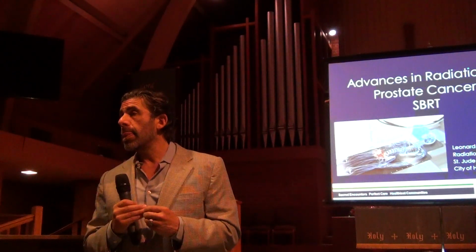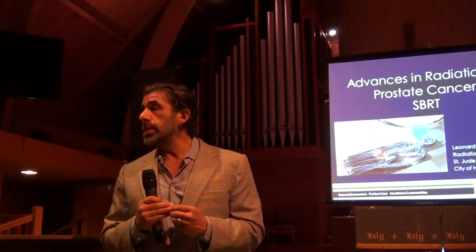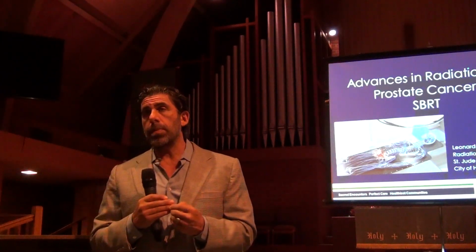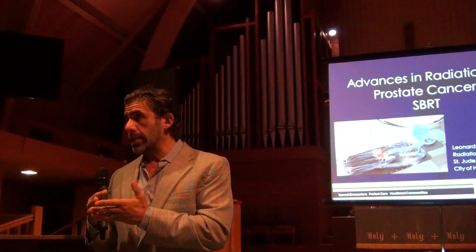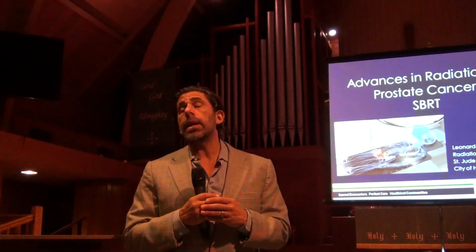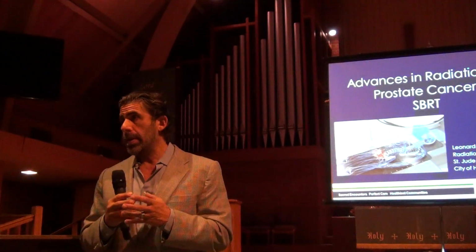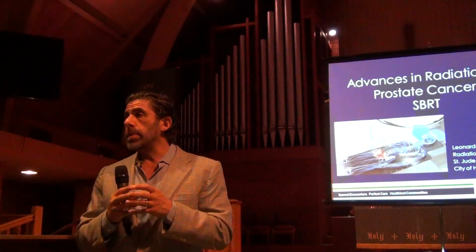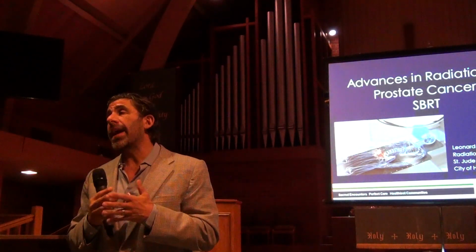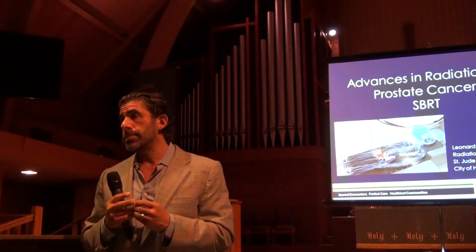Do you do it every other day, or could you do it consecutively? I do it consecutively. There isn't a consensus on whether consecutive or every other day makes a difference. Some people do every other day because they are worried about toxicity, but when we look at the data, it's mixed across the board. The only time I have gone to every other day is when patients have very, very large prostates, over 100 grams, which means there's a lot more bladder or rectum in the radiation field. So I want to take every precaution to decrease the side effects, and in that scenario, I may go to every other day.